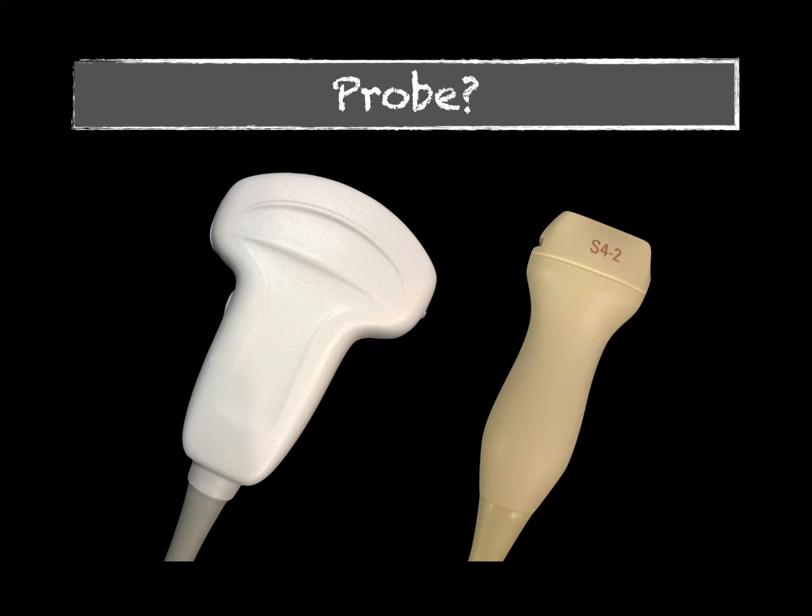You want to use a low frequency probe. You can use a curvilinear, more commonly known as an abdominal probe to many, or a phased array or cardiac probe. If you're using the phased array probe, make sure you're in an abdominal setting, and actually in either probe. That will have your settings for the machine set up correctly so that you can best image the gallbladder. Gives you a better frame rate, better image quality. So make sure you choose that abdominal preset.